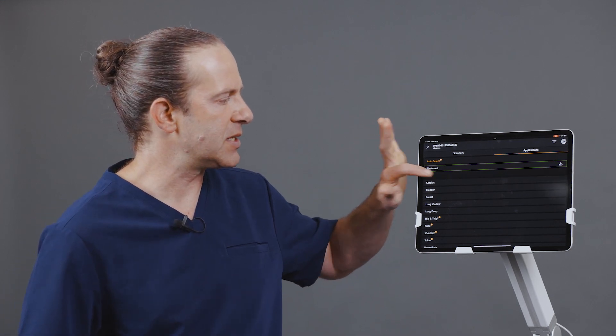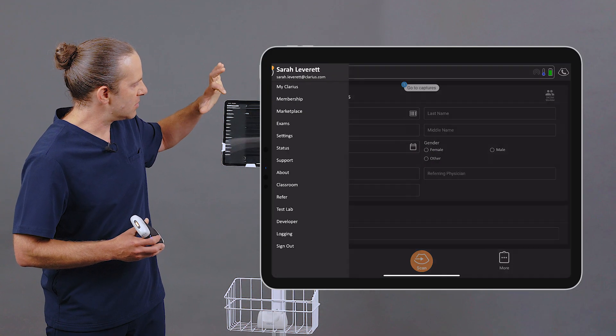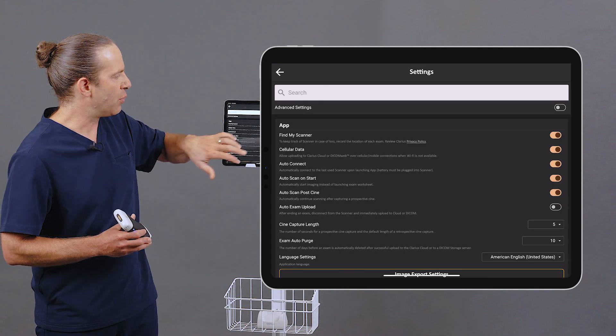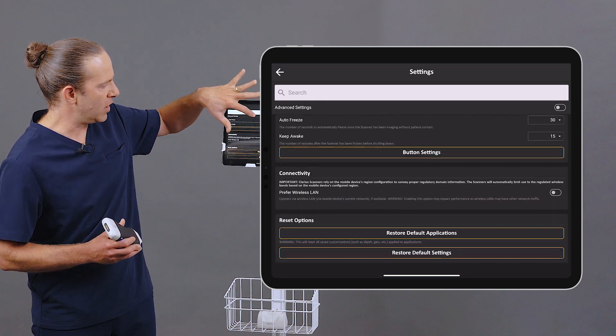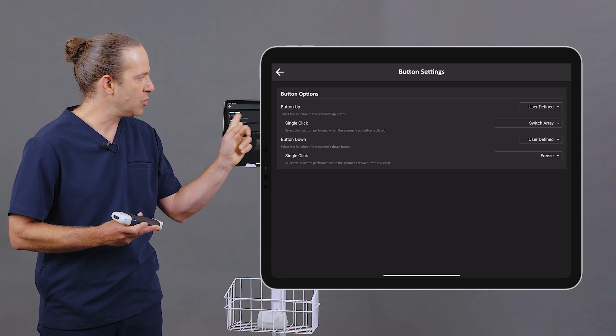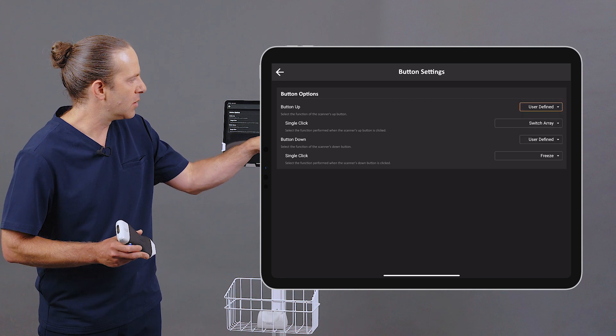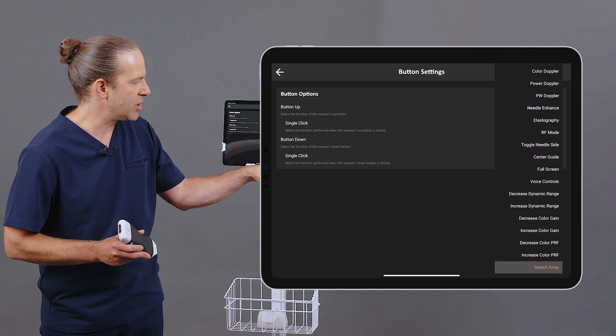The other way is to go in through the settings and preset, which just needs to be done one time. In button settings, I make sure that I'm going to choose Button Up as user defined, and I'm going to correlate it with Switch Array.